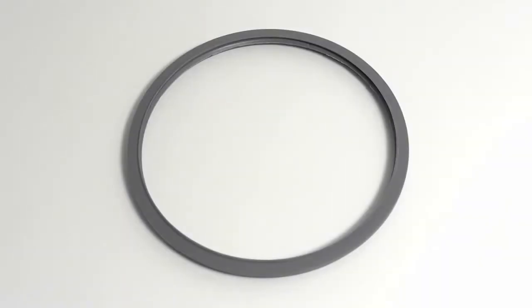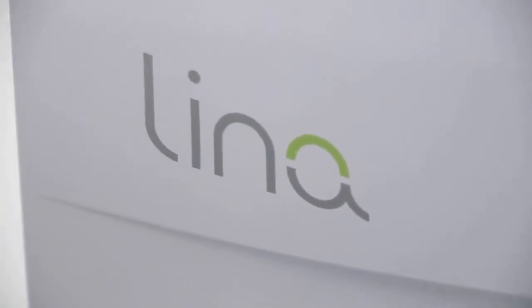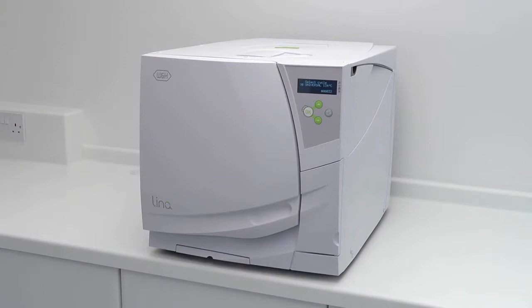The door seal is an integral component of your W&H Lina MB steriliser and regular maintenance is necessary to ensure continued safe operation in line with the Pressure System Regulations Act 2000. Poor maintenance is a common factor when dealing with faults.